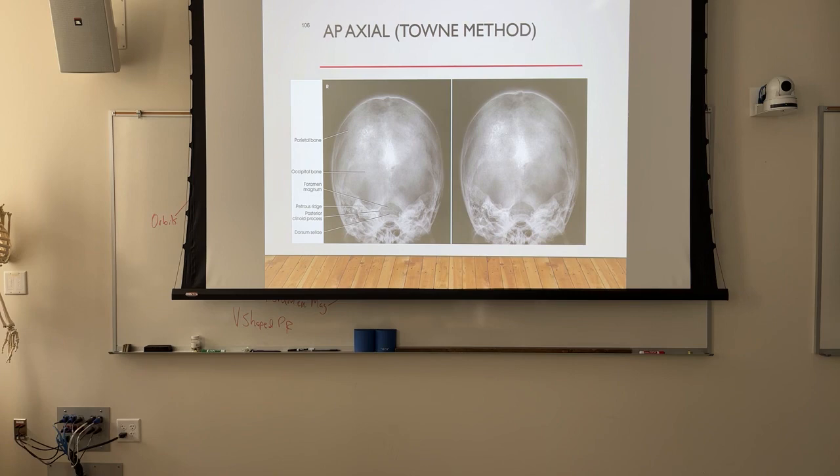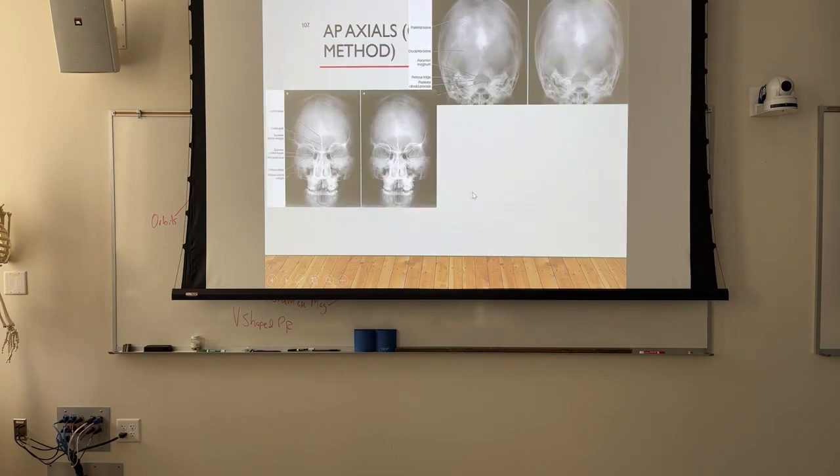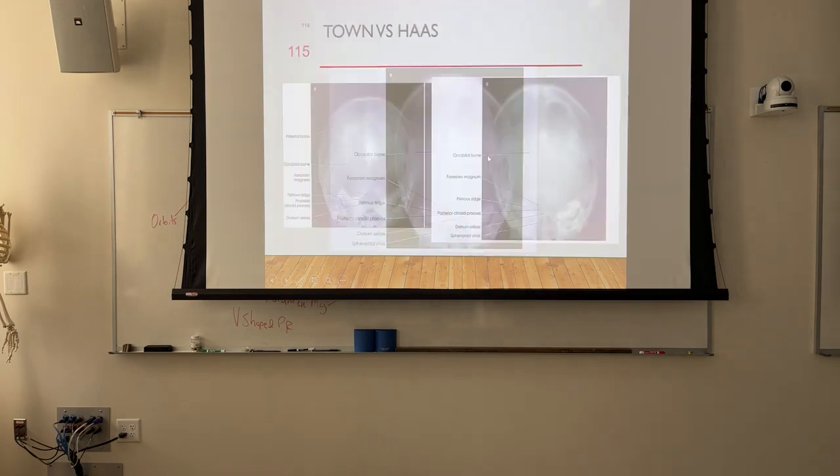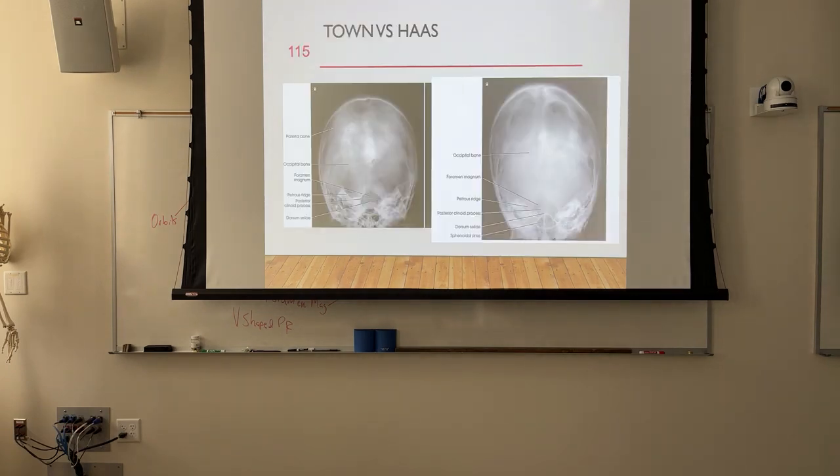So again, test question: to see the entire foramen magnum, you need to increase your angulation to a minimum of, says right there on page 48? 40, right. So you need to go to 40 at least, maybe all the way up to 60 for the foramen magnum. You see the foramen magnum, you just don't see the whole thing. Okay? Any questions on those?